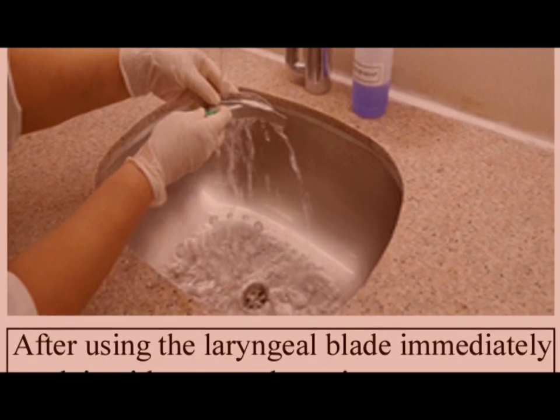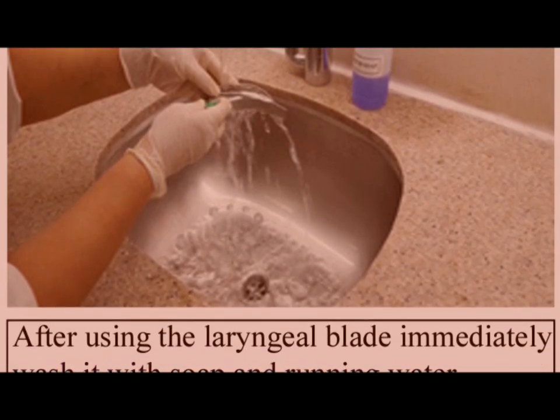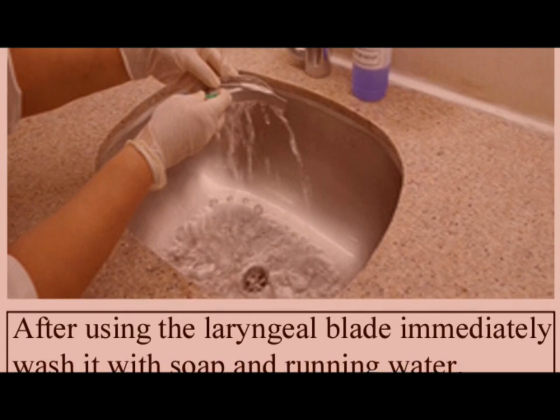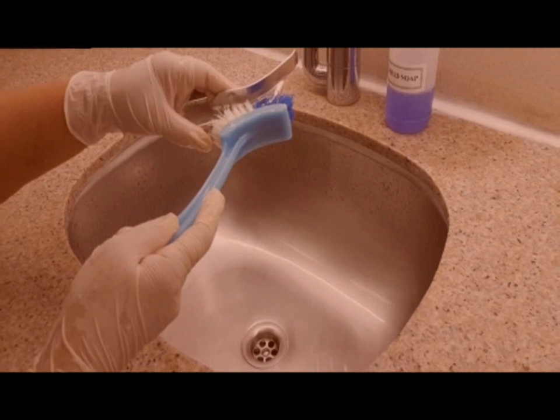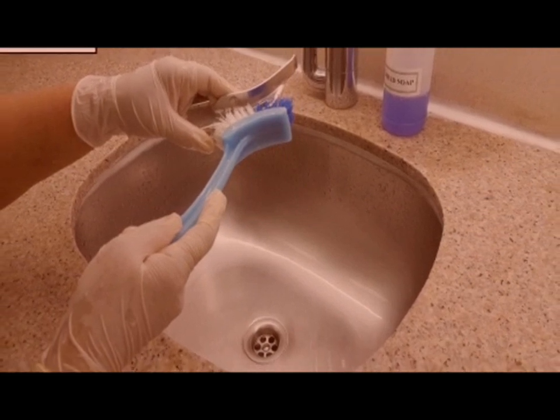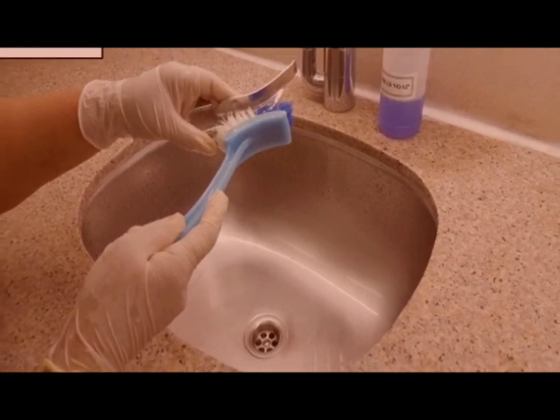After use of the laryngeal blade, we will wash it with soap and water in the soil utility. After that, we will clean the laryngeal blade with a brush to remove any visible contaminants.